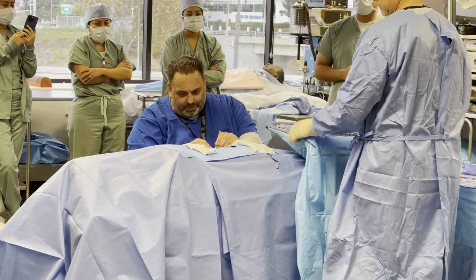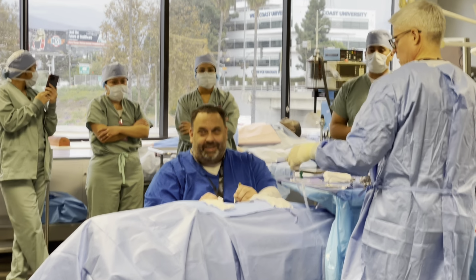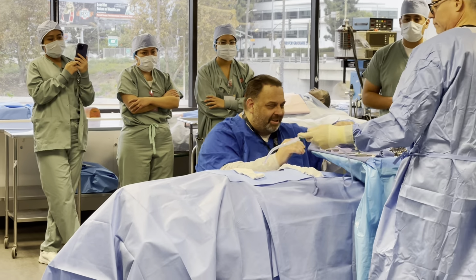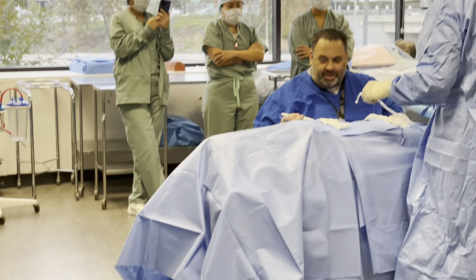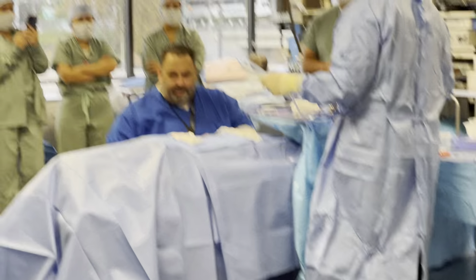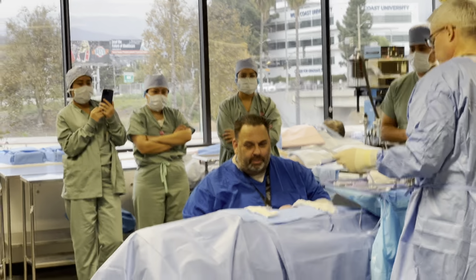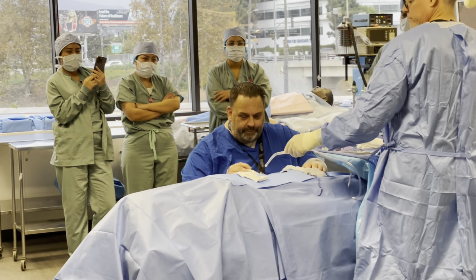I'm cutting the patient. What's gonna happen next, you think? They're gonna bleed. So what's likely is that I need the Bovie next, which means you need what? Suction. Why do you need suction? To catch the debris. To suck the what? The plume. Smoke, the plume. Why do they call it plume? What's in it?